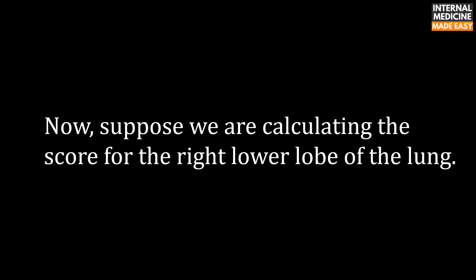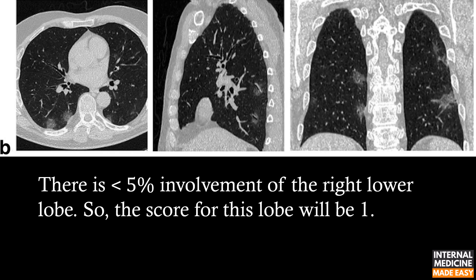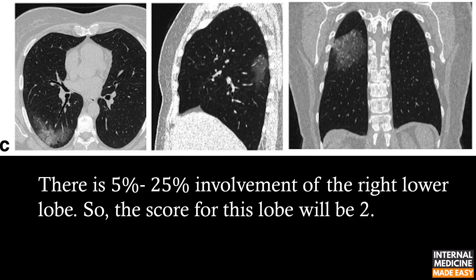Now, suppose we are calculating the score for the right lower lobe of the lung. In this CT, there is no involvement of the right lower lobe, so the score for this lobe will be 0. Here there is less than 5% involvement of the right lower lobe, so the score will be 1. Here there is 5 to 25% involvement of the right lower lobe, so the score for this lobe will be 2.